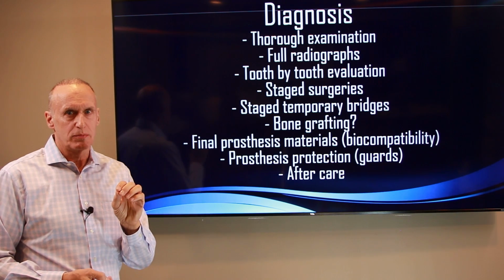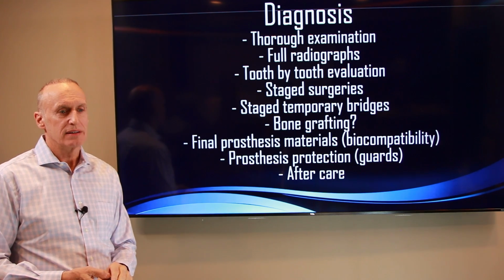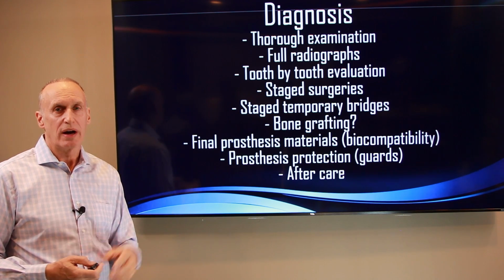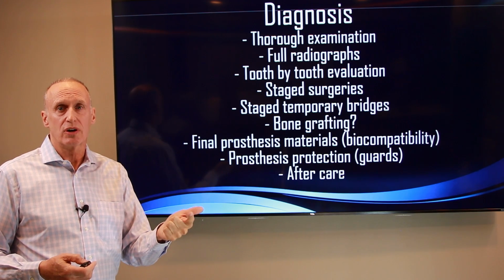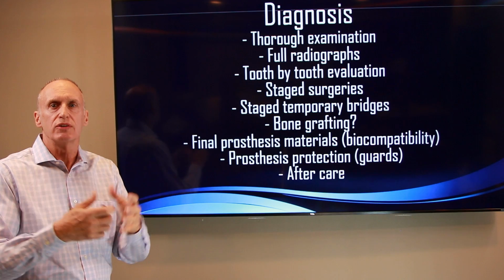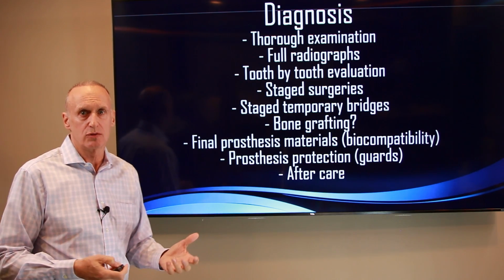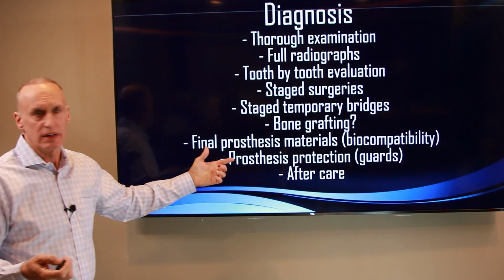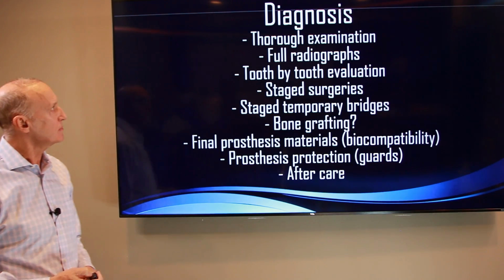Because there's a big difference between people who clench and grind and those who don't. And shockingly, probably 60% of our population grinds their teeth. So I don't like acrylic against acrylic, and I don't like zirconium against zirconium. There's a sweet spot in the use of the materials that will give you the longest lasting lifespan or service of these restorations. And how are we going to protect this if you are a grinder or a clencher? How are we going to protect it? How many times a year do you have to get your teeth cleaned?